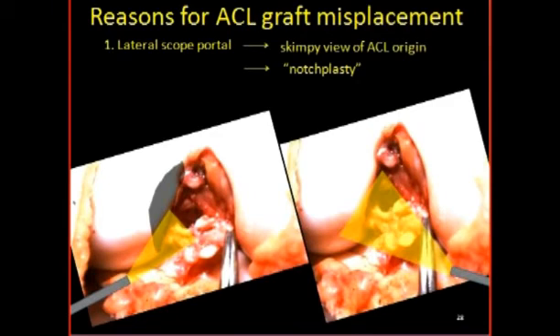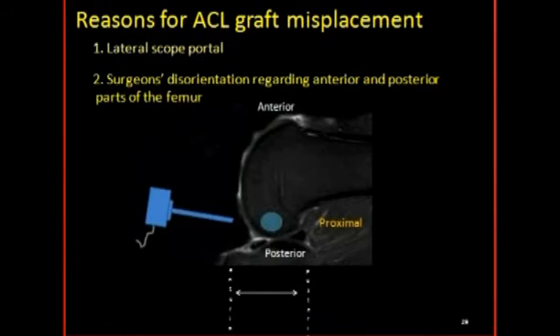It shows that there is no impingement of the ACL against the condyle, and certainly none with the roof of the intercondylar notch, and that a notchplasty will destroy normal bone and cartilage needlessly. Once again, when advancing a scope horizontally into the knee, it is traveling in a posterior direction only with respect to the flexed tibia. It is traveling proximally with respect to the femur. In order to go to the posterior part of the femur, the scope must look downward toward the floor.